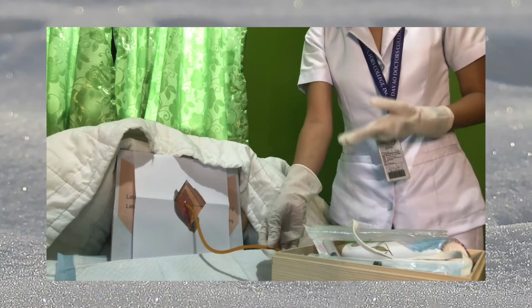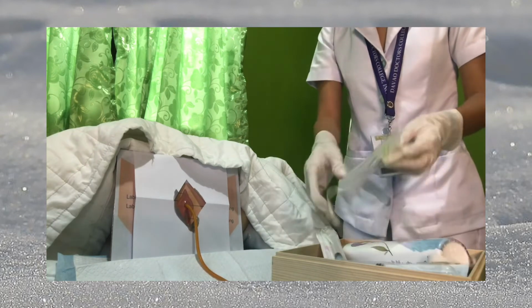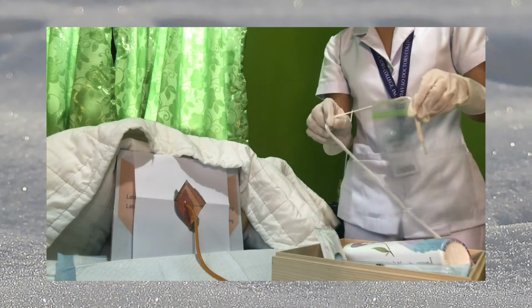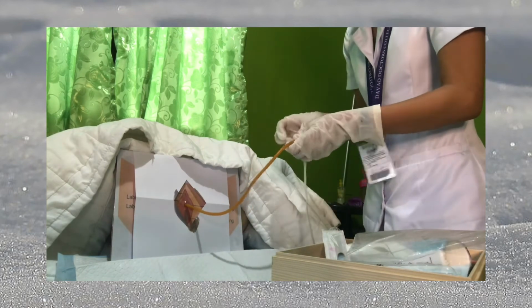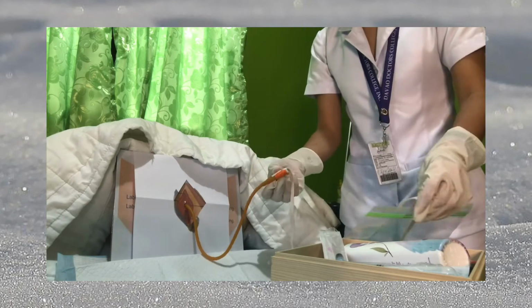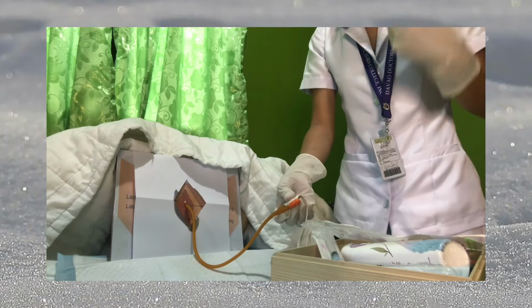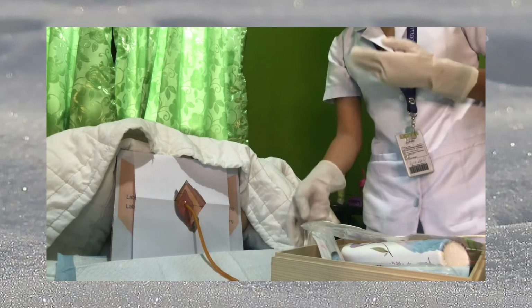Then afterwards, connect the catheter to the urine bag. Let's assume this is a urine bag. Now, let's inflate the balloon with 10 to 15 cc of sterile water using the 15 to 20 cc syringe.